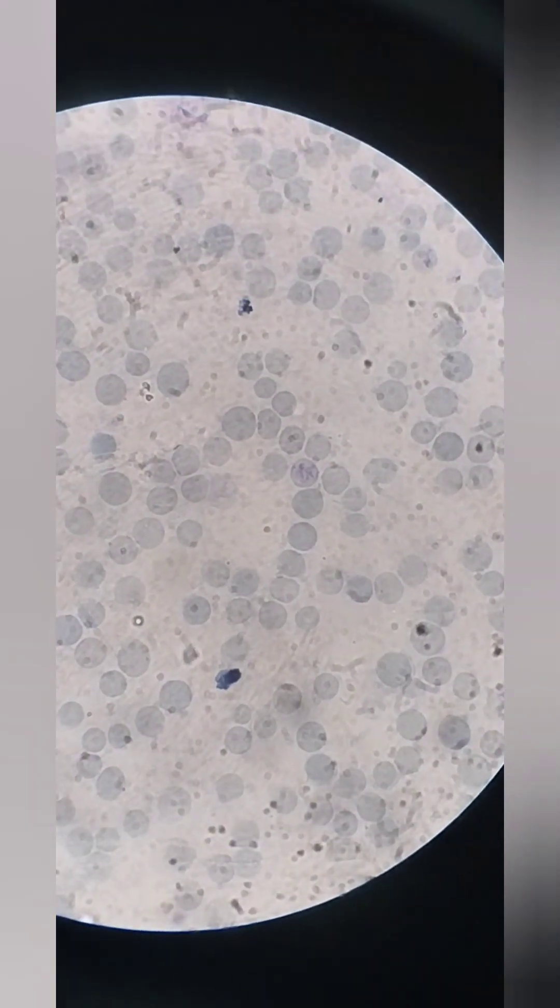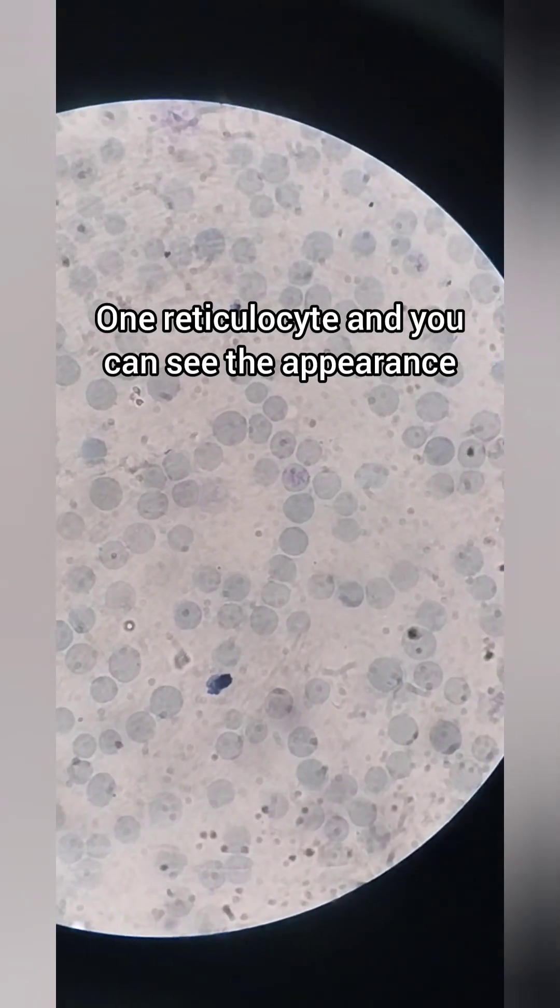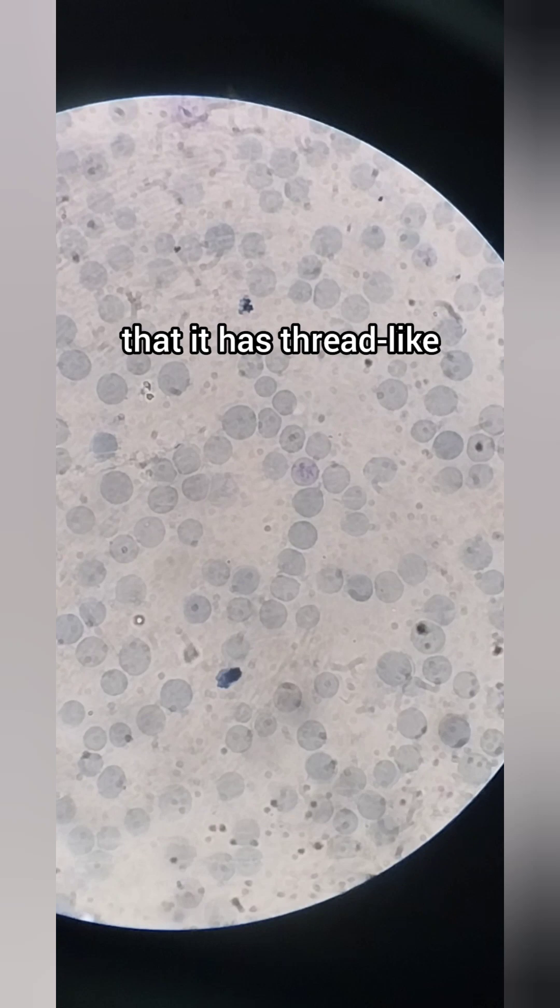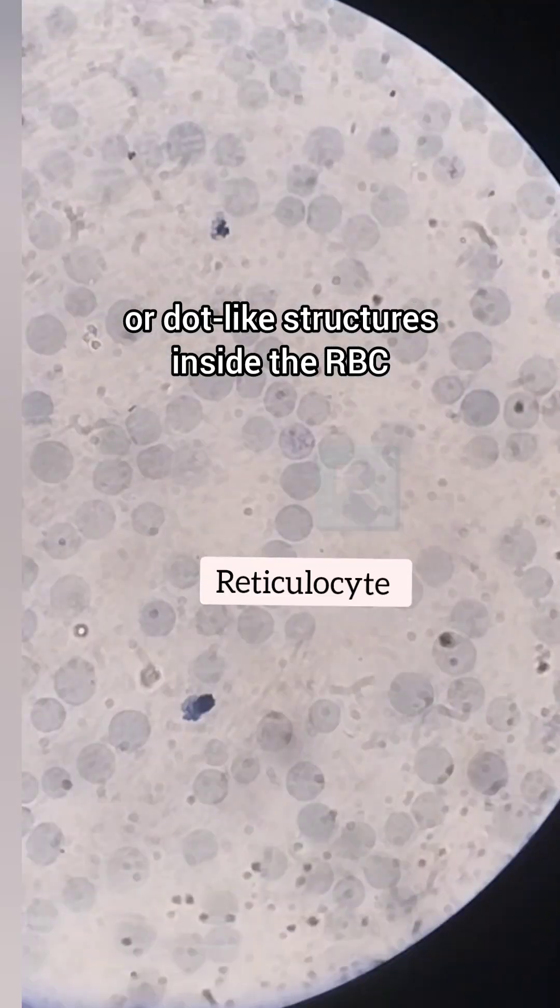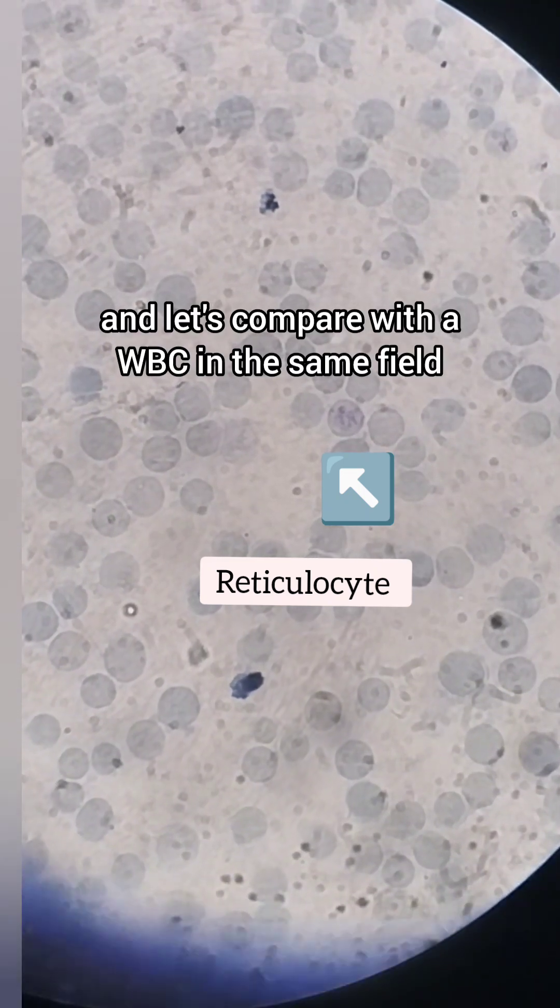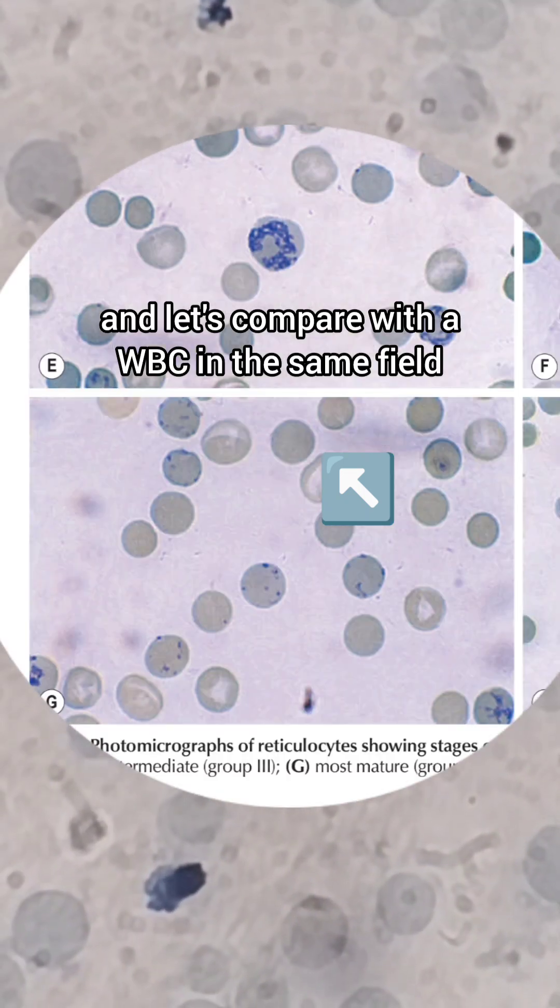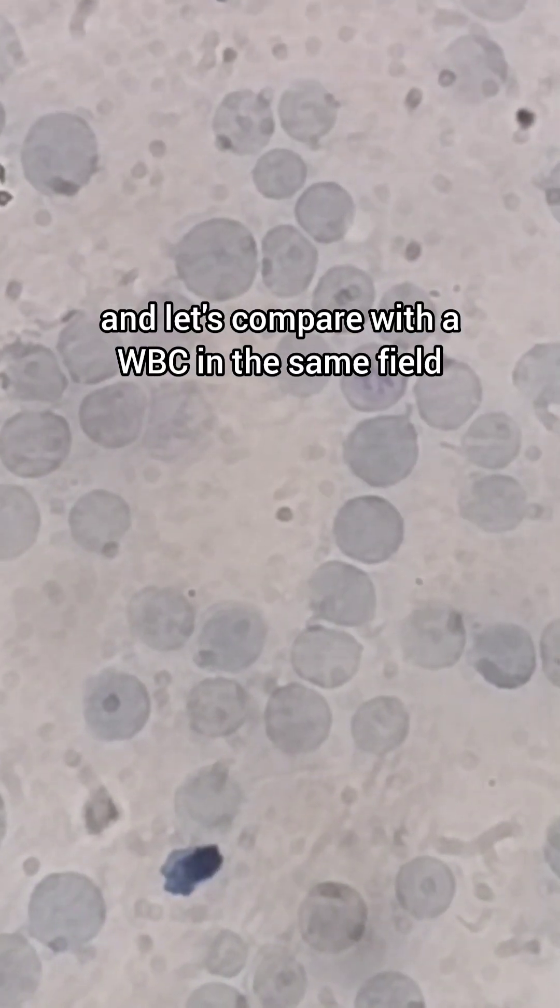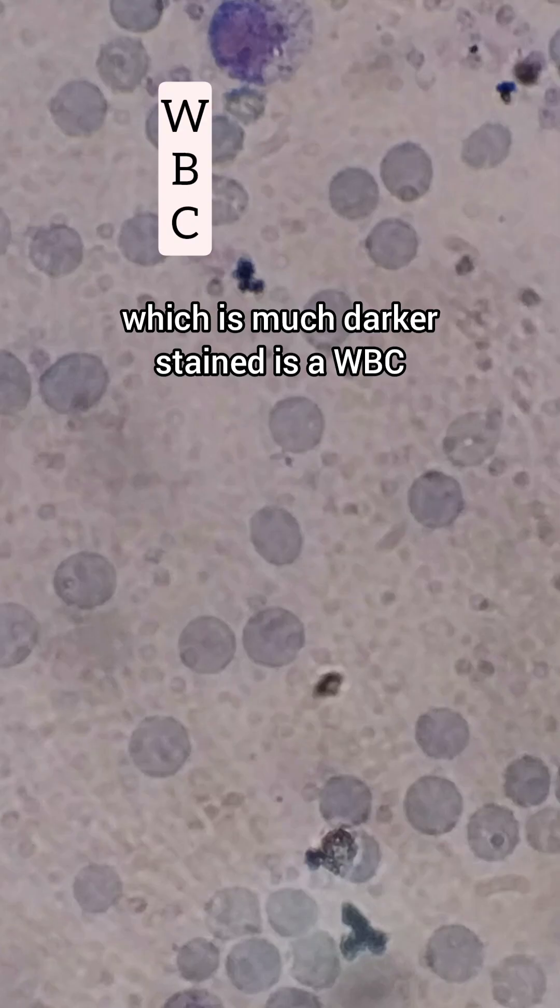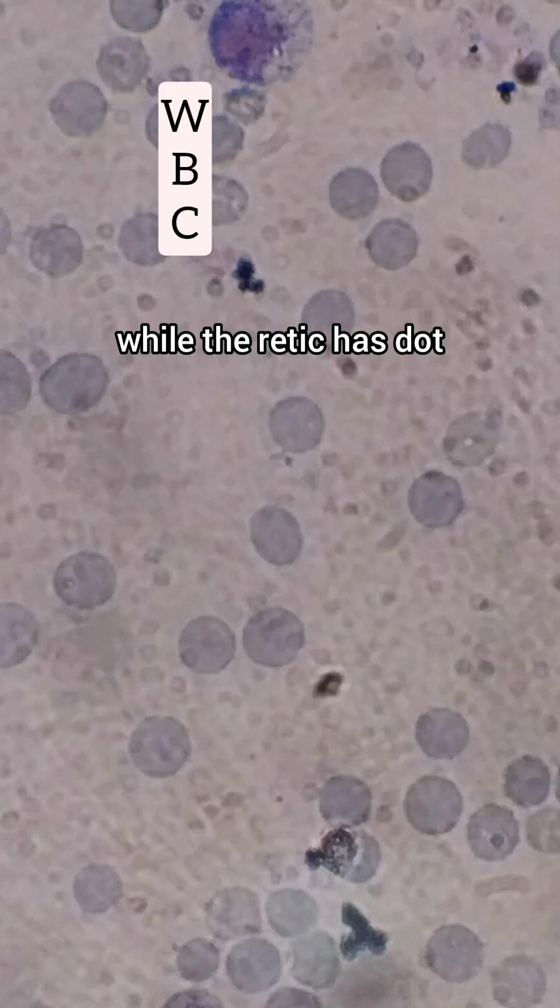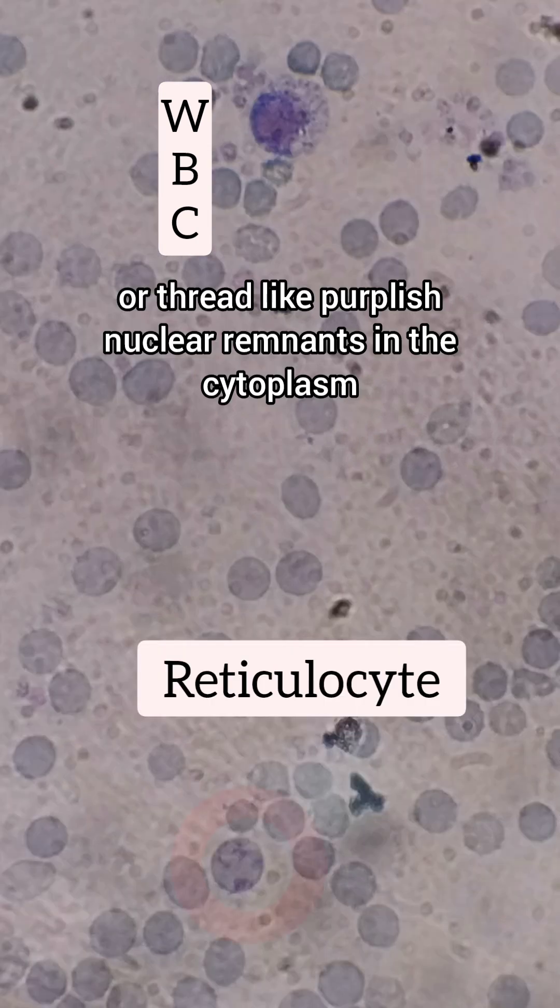One field is showing one reticulocyte, and you can see the appearance that it has thread-like or dot-like structures inside the RBC. Let's compare with a WBC in the same field. You can see that this one which is much darker stained is a WBC, while the retic has dot or thread-like purplish nuclear remnants in the cytoplasm.